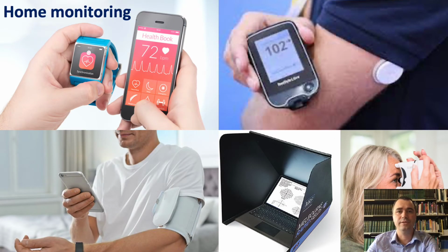The use of sensors to monitor health forms an important component of the management of several chronic diseases, including diabetes and systemic hypertension, and there are now devices available for home perimetry and home tonometry.